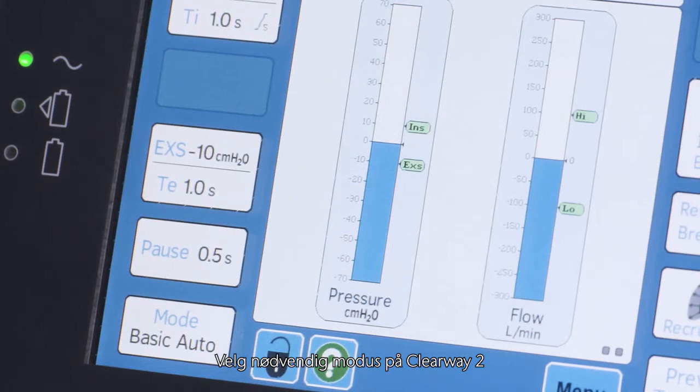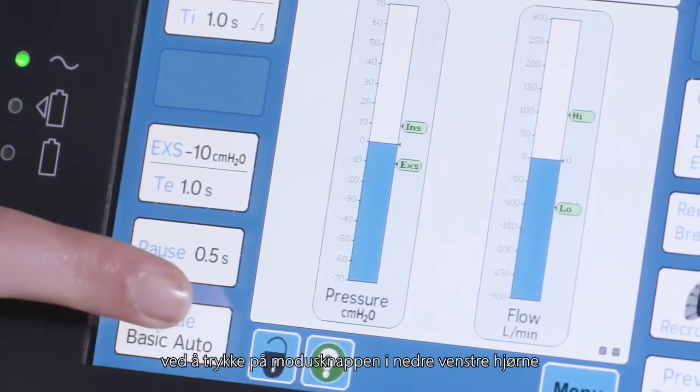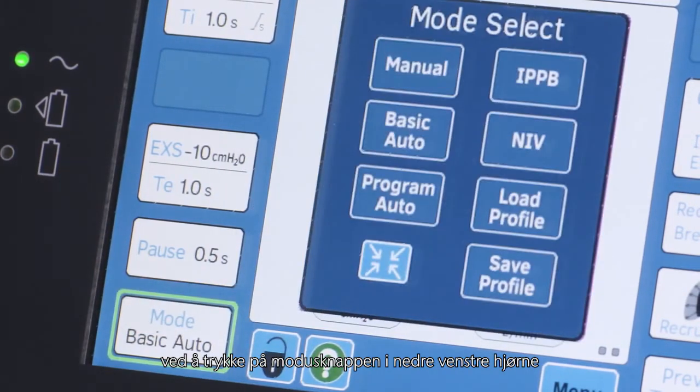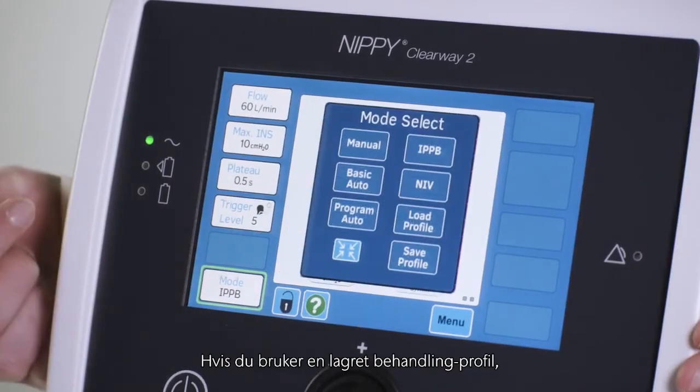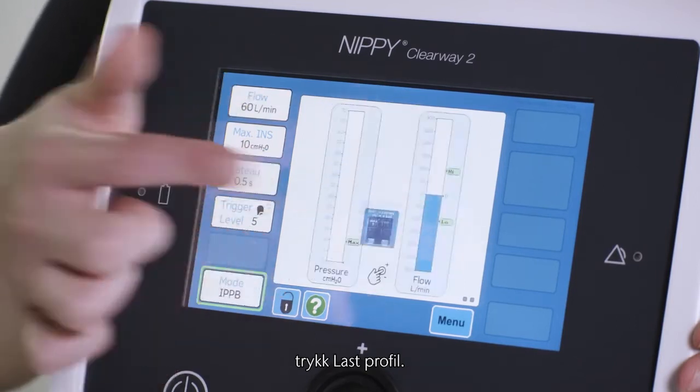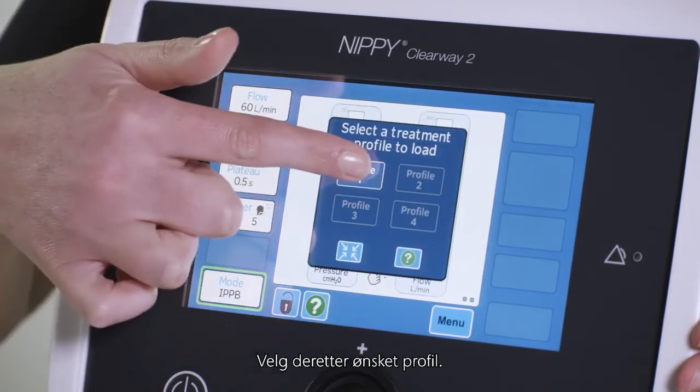Select the required mode on the Clearway 2 by pressing the mode button in the bottom left hand corner of the screen, then selecting the mode. If you are using a saved treatment profile, press load profile then select the required profile.